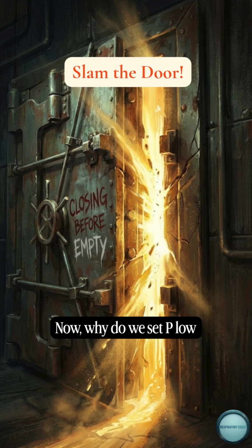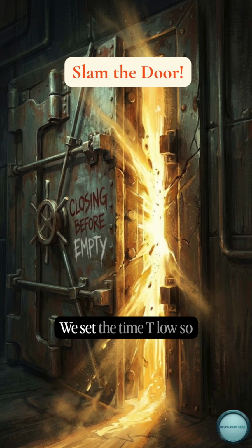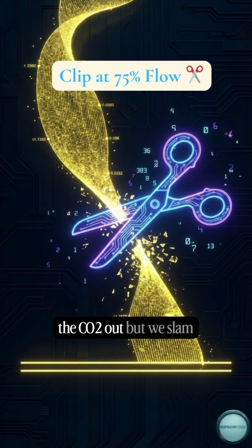Now, why do we set P low to 0? Isn't that dangerous? Won't the lung collapse? Not if you time it right. This is the most critical part of the video, controlled auto PEEP. We set the time, T low, so short that the patient cannot empty their lungs completely. We open the door to let the CO2 out, but we slam it shut while there is still air rushing out. This traps gas in the alveoli. Even though the setting is 0, the actual pressure in the lung never hits 0. This is called the 75% rule. We cut off the flow when it's still 75% of peak flow.